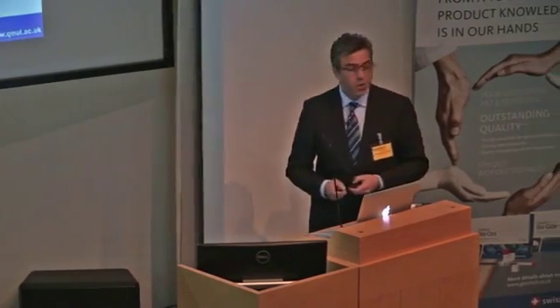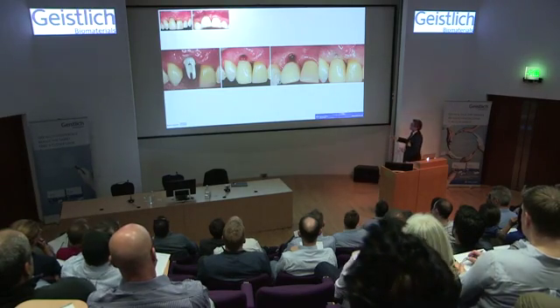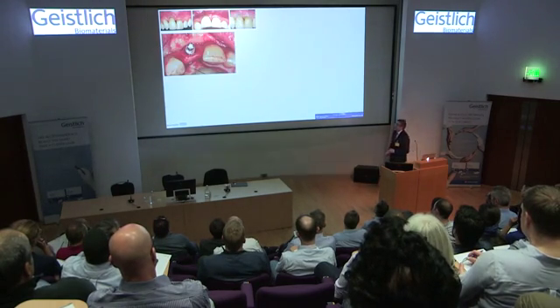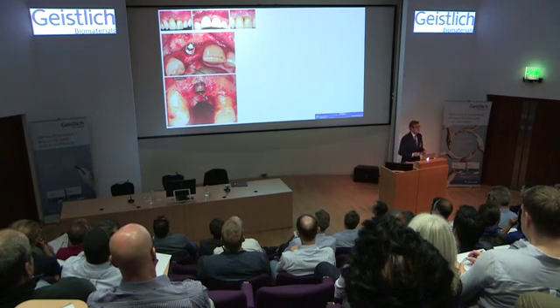So no matter how much bone and which type of bone goes in, if our implants are not in the correct place, we have a problem. And as it heals up over a 4 or 5 week period, there is the implant opening, and then we go in to explant this implant. And you can see how buccally this implant is placed. You can see the effects of a buccally positioned implant. There will never be any bone buccally on that implant.